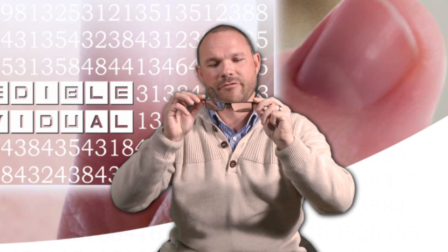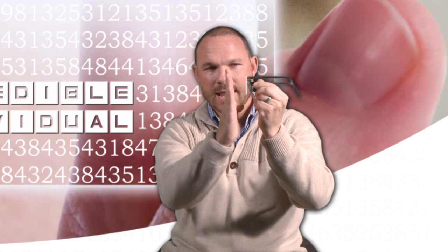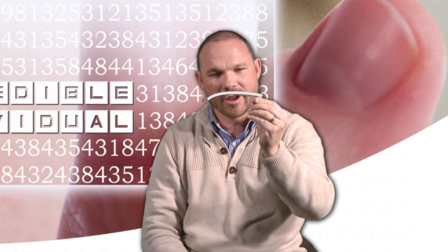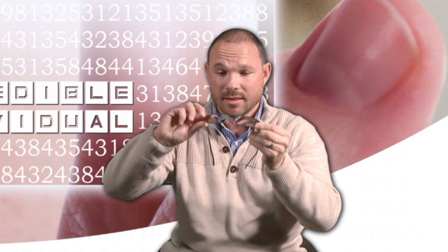Now, I'll show you on my own frame. When we look at my frame, for instance, my frame is not perfectly flat. There's an angle to my frame, different from the absolute vertical. If I hold my frame like this, it's also not flat. There's a curve to it. We call it the frame faceform angle. And then, this being a metal frame, it's got adjustable nose bridges, so we can adjust how far this lens is from my eye. But let's say it was a plastic frame, and that would sit a lot closer.